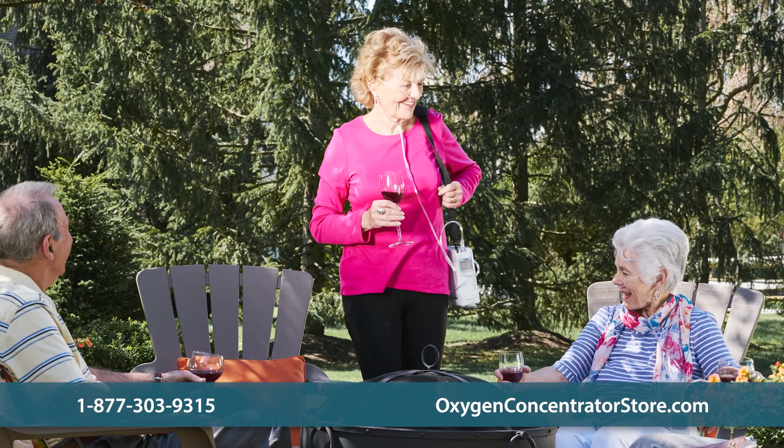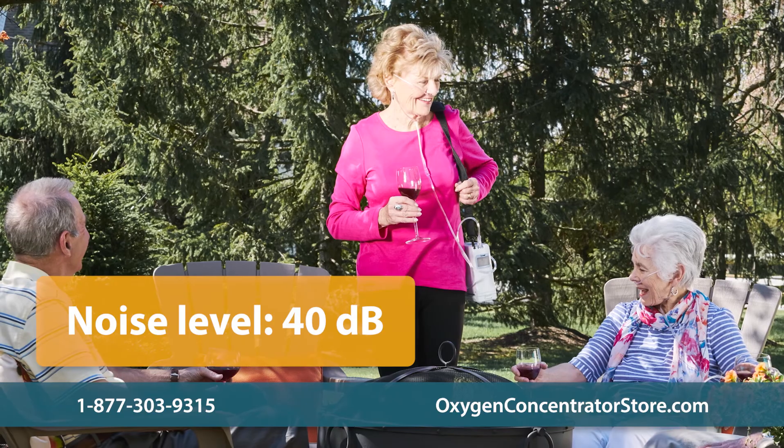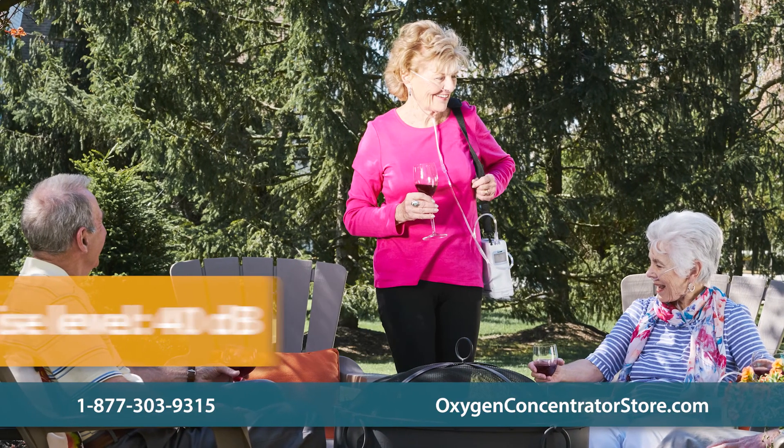The G4 is one of the quietest portable concentrators. At 40 decibels, it produces less noise than a normal indoor conversation.